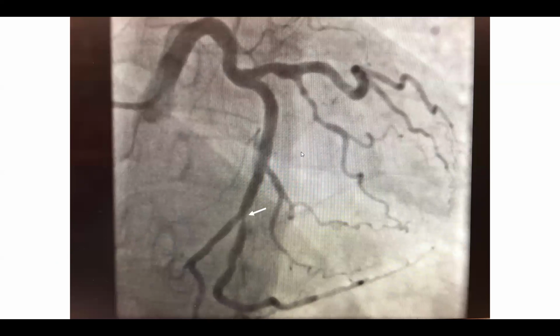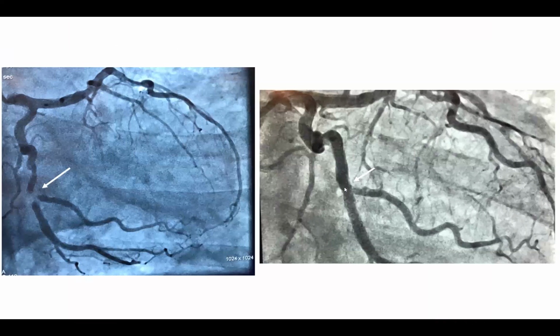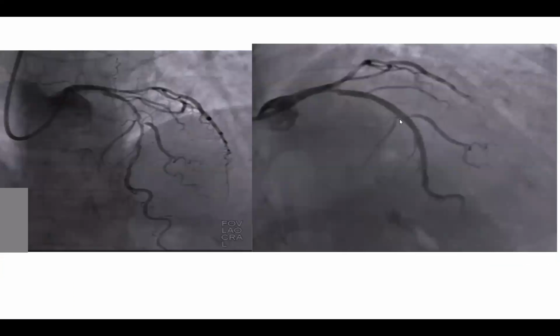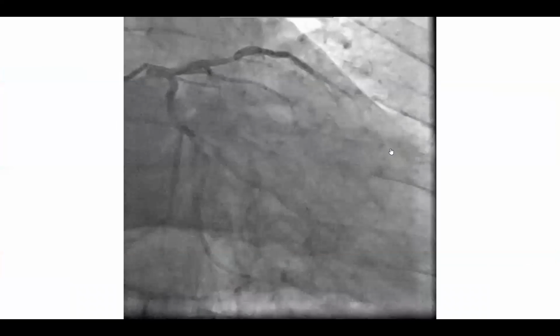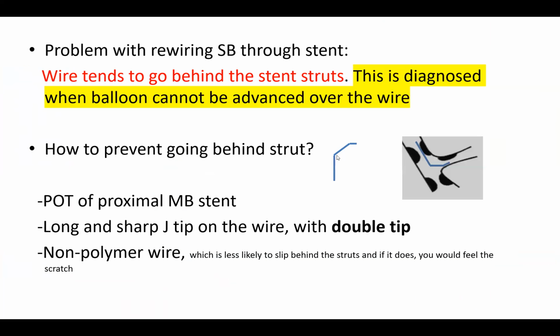You have a large caliber vessel. Here I will put a 5-6 millimeter tip on it proximally. You have a smaller vessel. I will put a smaller proximal band, a smaller length. So the length of this, where you put it, depends on the caliber of the main branch.